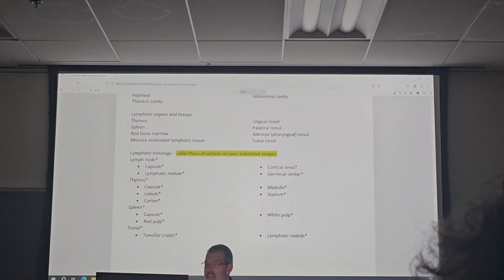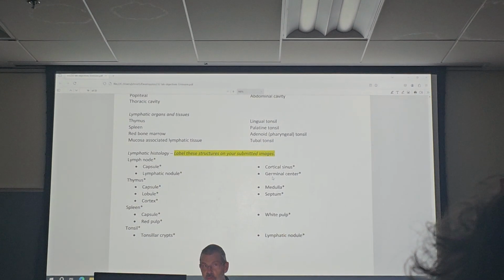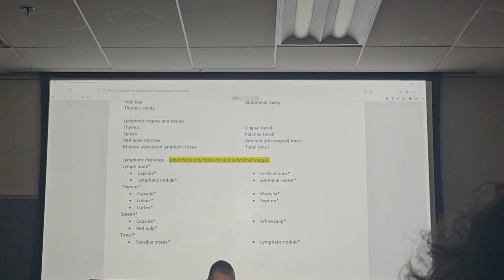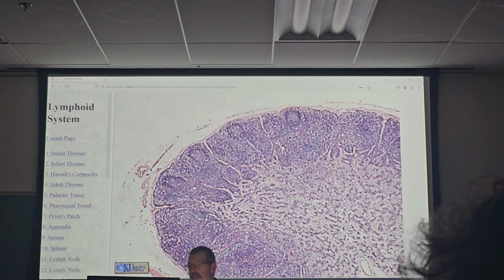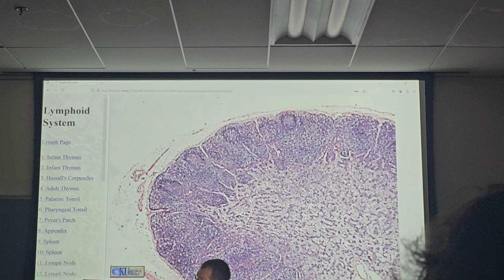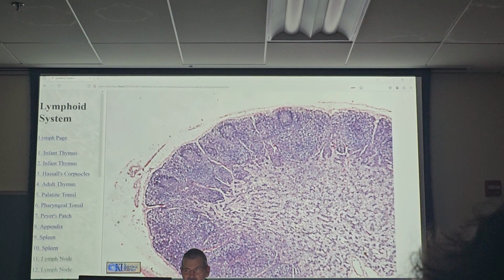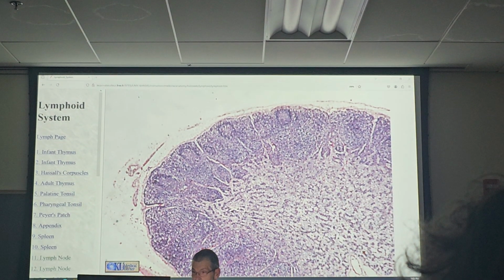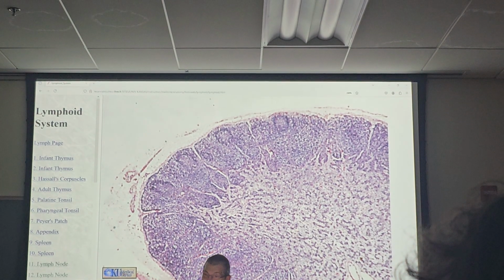All right, we gotta find a nodule and a center. They're related. They're not the same thing, but they're related to each other. So if you find one, you shall know the other one. I'm gonna look in this darkness. You look right up there where my mouse is. So there's like a weird circle, like someone drew on it. That's what they're referring to. You notice there's one here, there's one here, there's kind of one here. You have to squint a lot and get one there.